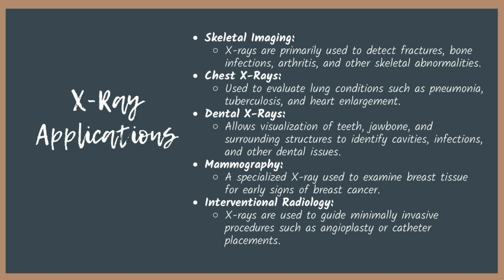There are also many different applications for X-ray imaging. So we have skeletal imaging. X-rays are primarily used to detect fractures, bone infection, arthritis, and other skeletal abnormalities. Chest X-rays, these are very helpful in evaluating lung conditions such as pneumonia, tuberculosis, and heart enlargement.